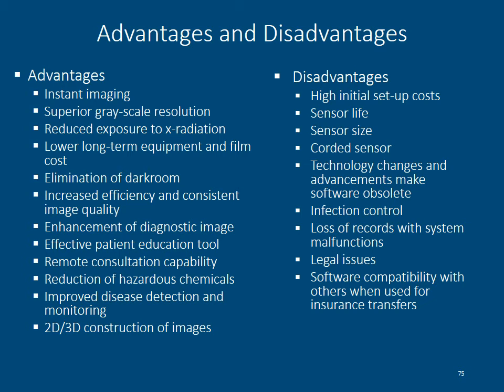There are also legal issues with digital imaging. Someone can actually get into the films or into the image on the sensor on the computer and change the pixels to eliminate or cover up any type of lesion that may have been overlooked in an exam, in a consultation. Software compatibility is an issue when the images are sent from one computer to another. So these, though good and wonderful for dentistry, do have advantages and disadvantages that we must be aware of.